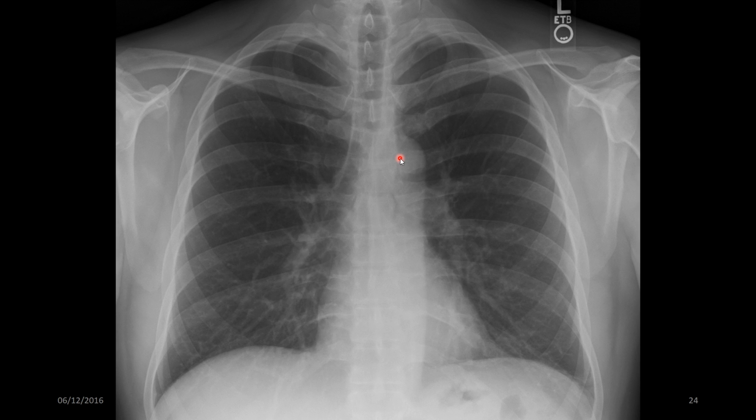And again, we move on to something that I was talking about, chest X-rays. So we don't know whether this is PA or AP because it isn't marked. Although there was a general consensus that unless it's marked AP, you assume it's PA. You assume it's PA unless it's marked AP.